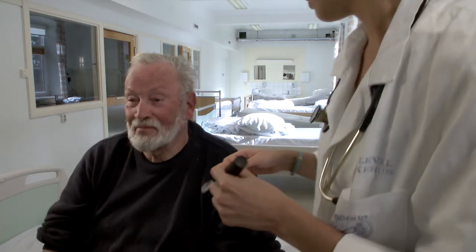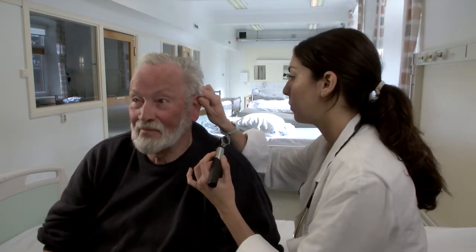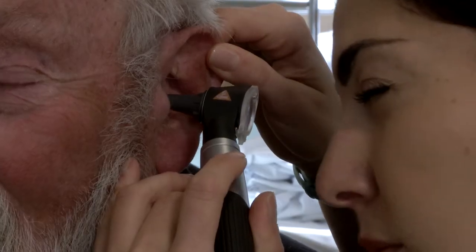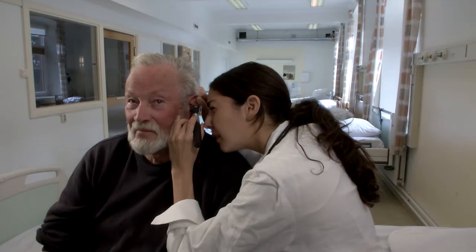The otoscope exam allows for examination of the external canal and middle ear. With a disposable specula on the end of the otoscope, hold it like a pencil. Use your little finger side of your hand to stabilize the otoscope from going deeply into the patient's ear.